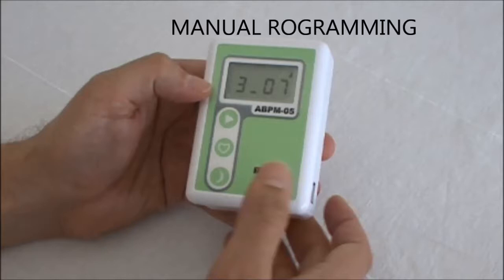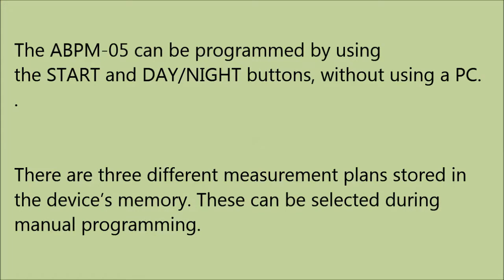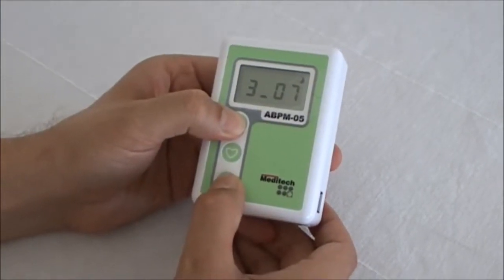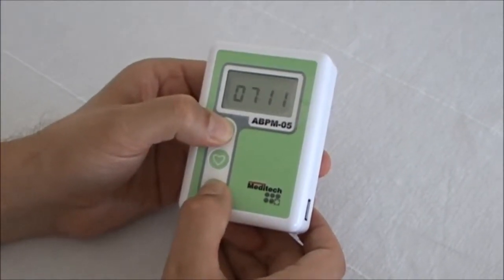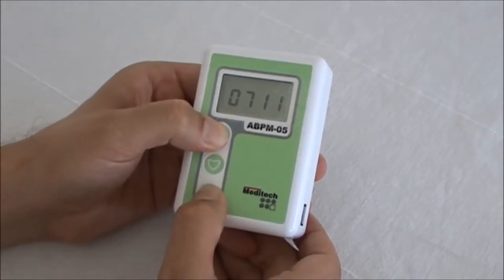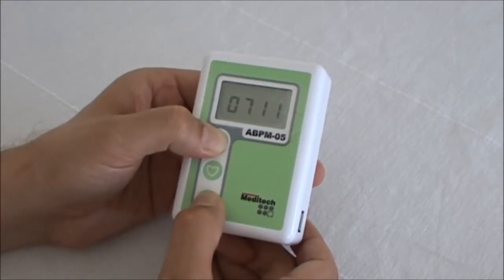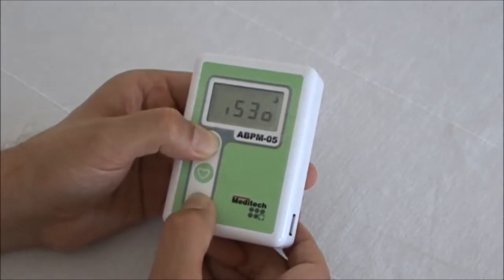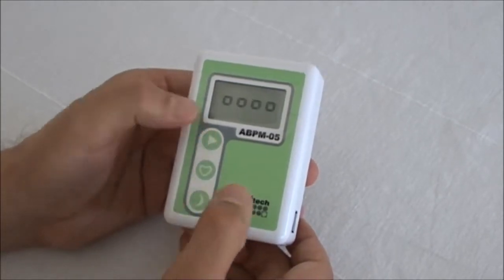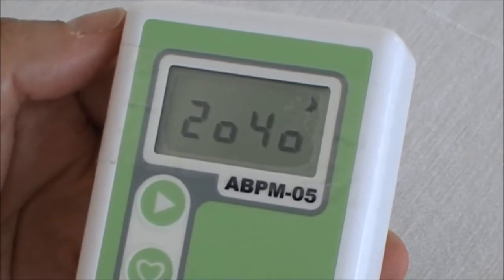Through the process of manual programming, one of the three permanently stored programs is selected and activated. Selection is by simultaneously pressing and holding the two buttons. Activation is by lifting the fingers off when the desired program ID appears on the LCD. Confirmation of the selection will be indicated by four blinking zeros, and the programming ID will also be displayed briefly.